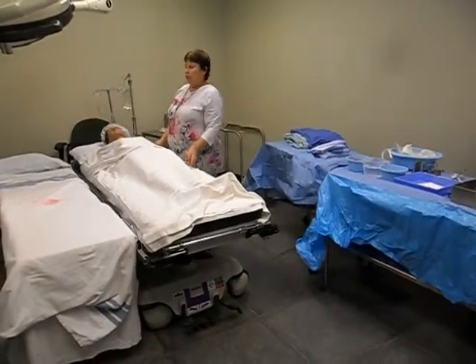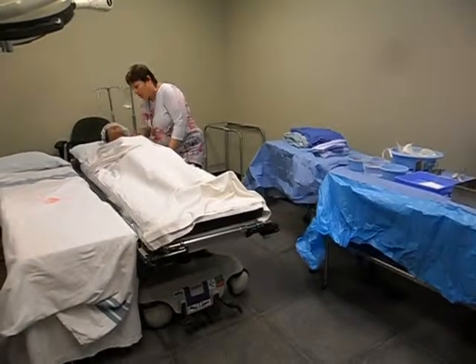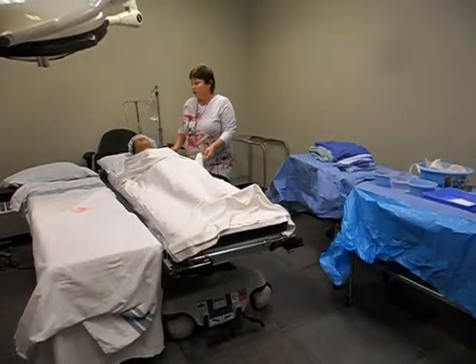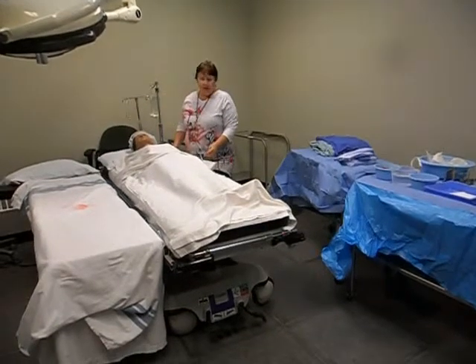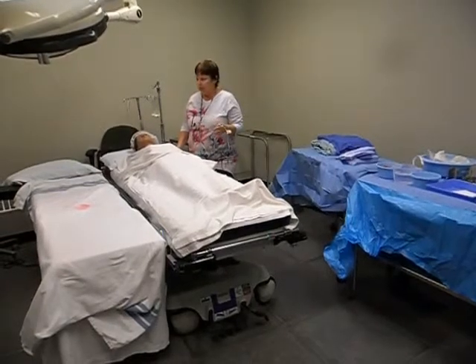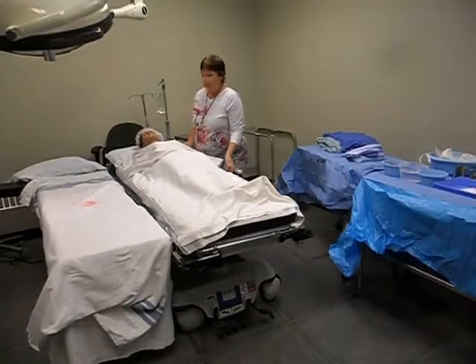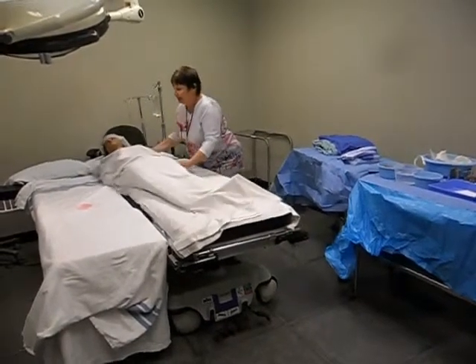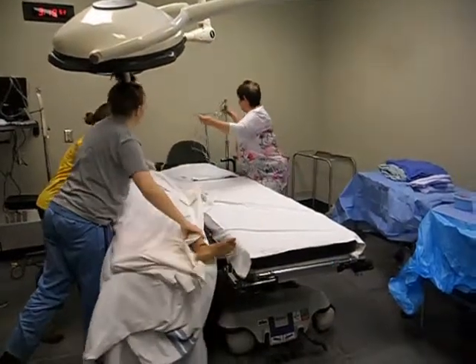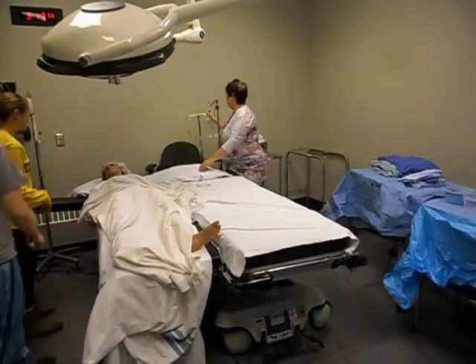And now if she can move on to the other bed, we would say, Mrs. Hanson, do you think that you could move on over to this other bed here? And if she says, oh, sure, great. If she says no, then this is when we want to get lifting help and get a slider board or roller board. And then we would have her go to the other bed. And so we'll pretend that she can move herself. Caitlin and Kristen, help me get that over there.